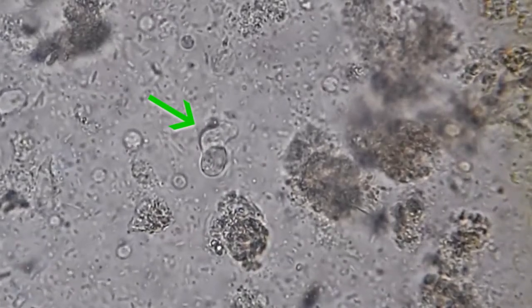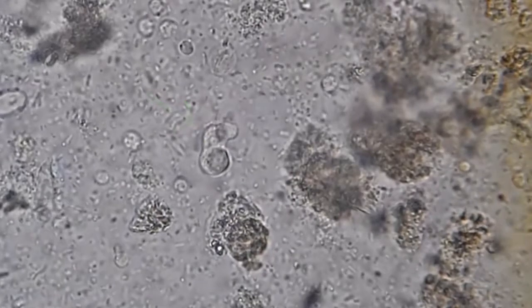moving trophozoite here. It has a direction of movement. It sticks out pseudopodia and actually moves in a specific direction. It actually has a directional movement. Those pseudopodia are quite long and it's moving quite quickly.